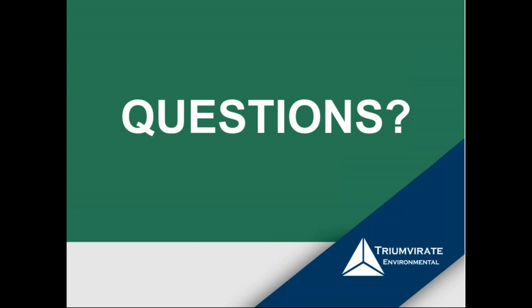Good. Okay, so we got this one from Carol. Here we go. Do most newly sold hematology automation machines use sodium azide? Surprisingly, yes. And they won't allow anything else. It's what their system utilizes. I've had clients call manufacturers and ask for an alternative solution, and they just won't provide that. So it is still very common.